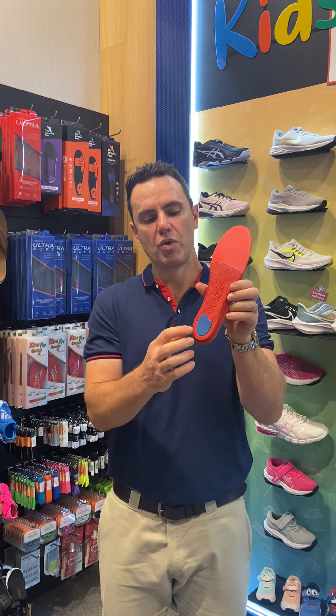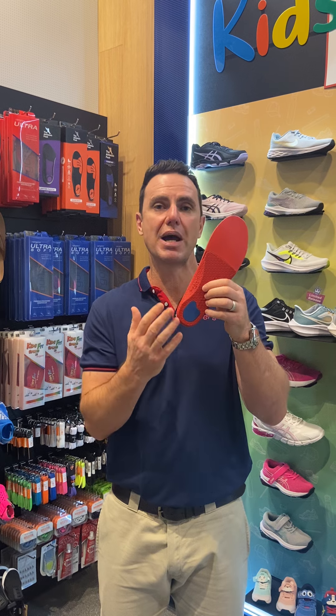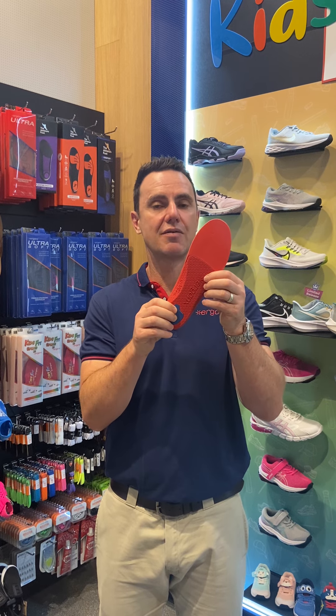It's got this rear foot cushioning position because quite often what we get in a child's foot, at about the 11 to 12 year olds, they get heel pain called Sever's disease. So if we can cushion this area up, it makes it a lot more comfortable across the school day and they're less likely to get Sever's disease pain.